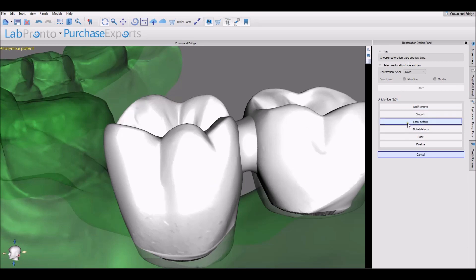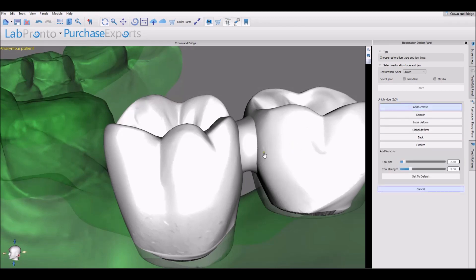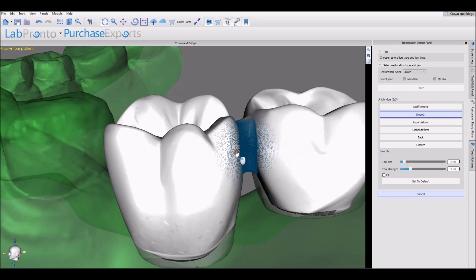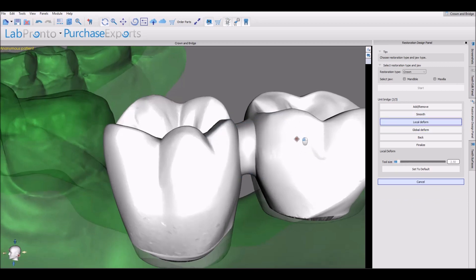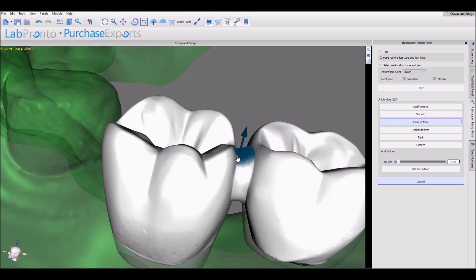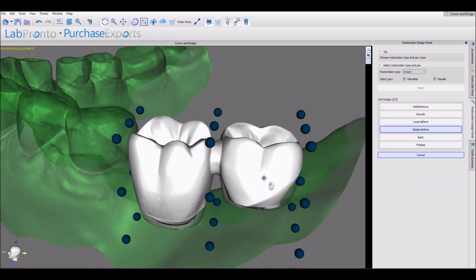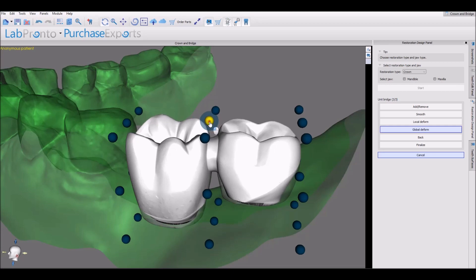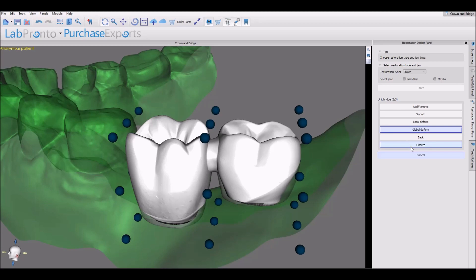Now the software gives us the usual design tools that we could use to edit the bridge: we can add and remove material. The Shift key adds material, and the Control key with our left mouse button removes material. Smooth smooths everything out. Local Deform allows us to grab any surface and modify it. Global Deform allows us to grab any of the nodes and modify the design, along with abrasion. And then once we're done, we can click the Finalize button.